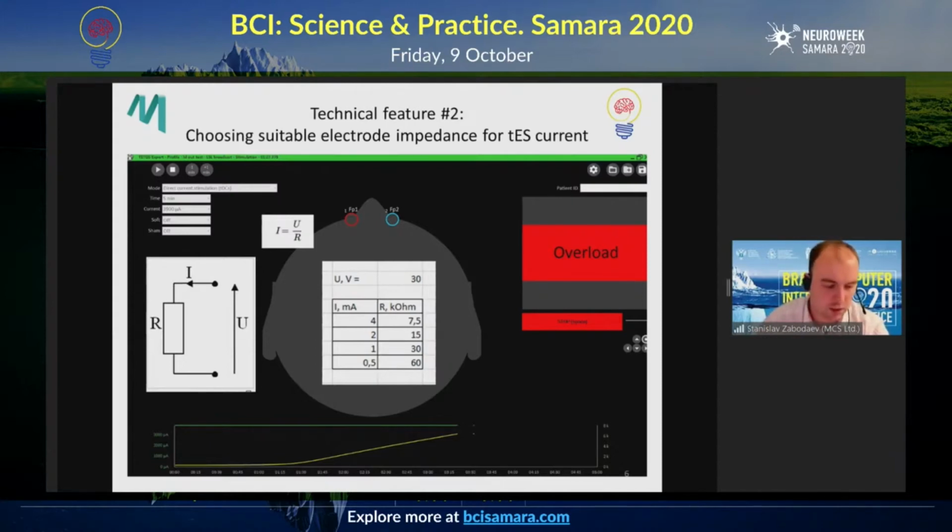If you use, let's say, a regular stimulator, a Chinese-made stimulator, it will work for some time, but not all of them can deal with electrical overload. When we are talking about DC generators, they usually have a maximum voltage threshold. So in order to estimate whether the electrodes have been placed correctly and whether the following stimulation will be successful, you can do that with an impedance meter.